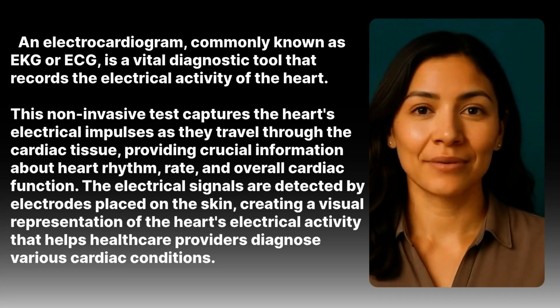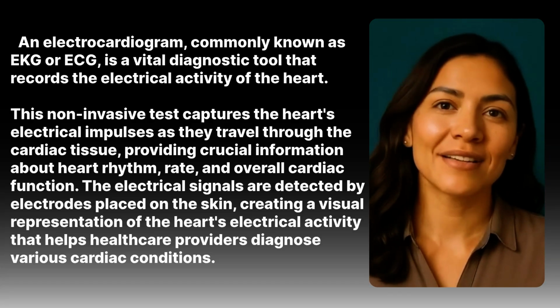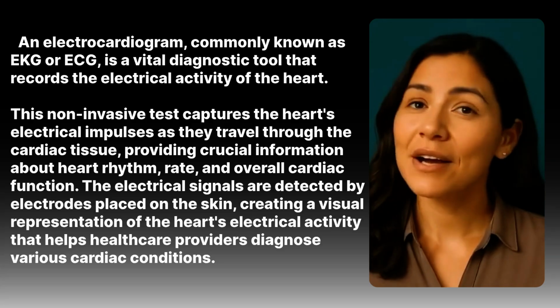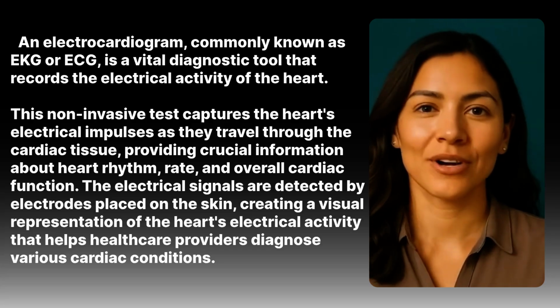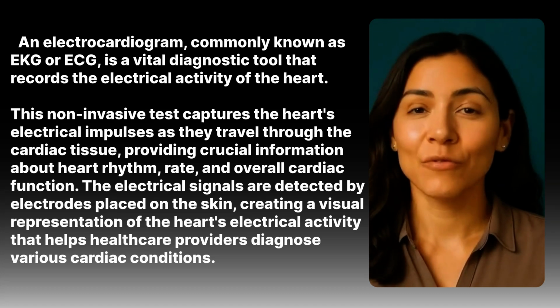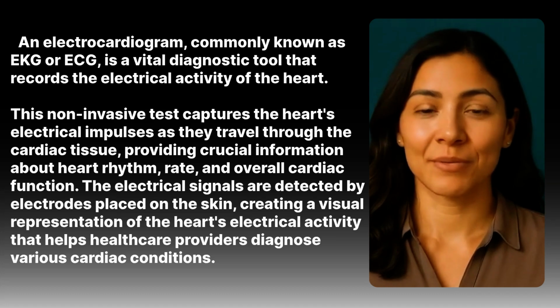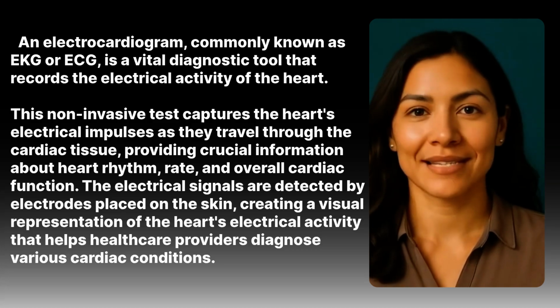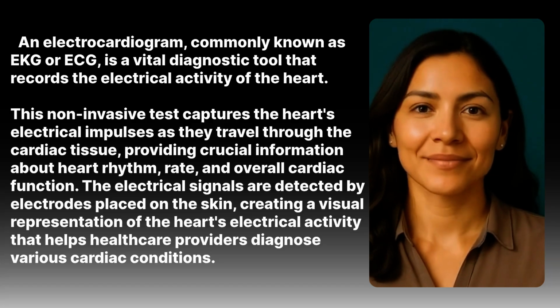An electrocardiogram, commonly known as EKG or ECG, is a vital diagnostic tool that records the electrical activity of the heart. This non-invasive test captures the heart's electrical impulses as they travel through the cardiac tissue, providing crucial information about heart rhythm, rate, and overall cardiac function. The electrical signals are detected by electrodes placed on the skin, creating a visual representation of the heart's electrical activity that helps healthcare providers diagnose various cardiac conditions.